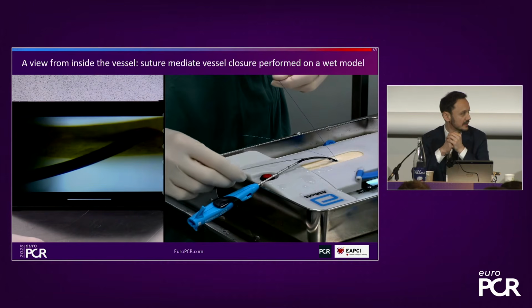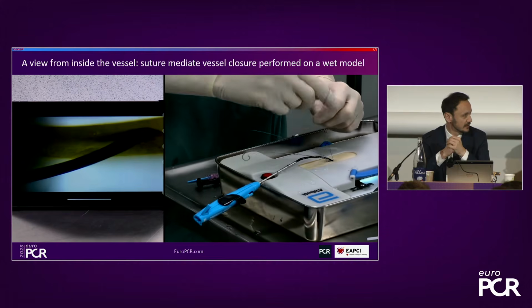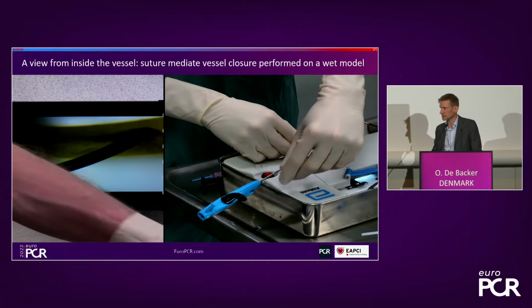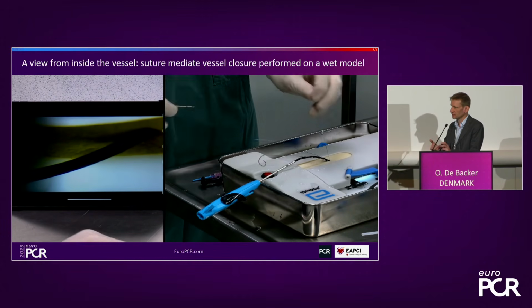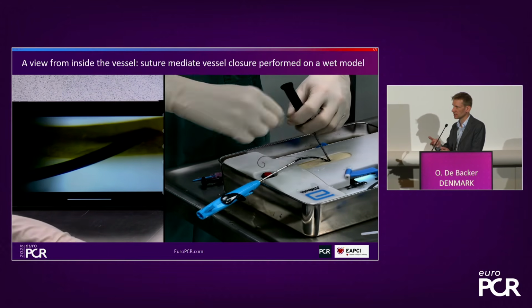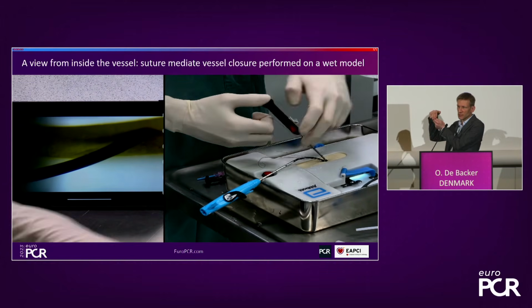I think if there is bleeding, you should not deploy. That means that you are not in contact with the vessel. Exactly. And that could be because you have maybe entered too far in, and then you opened up the anchor, but you're stuck behind a little bit of calcium, but you're still in the vessel, far too deep. Then it's better to close it down again, take it out again, and go in.